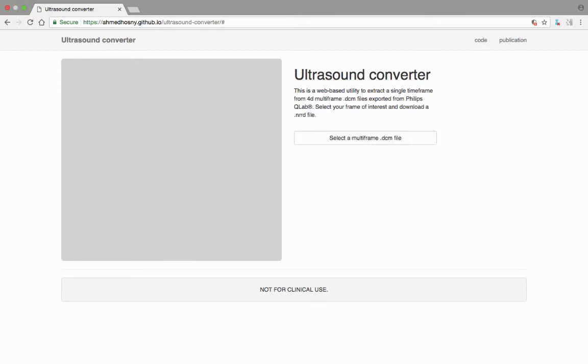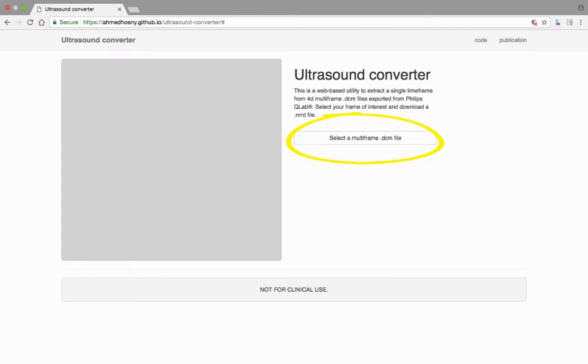Once the DICOM file has been downloaded from the ECHO machine and the specific frame of interest has been determined, you are ready to begin the file conversion process. In the middle of the screen on the site, you will see a link that says Select a Multi-Frame DICOM File.